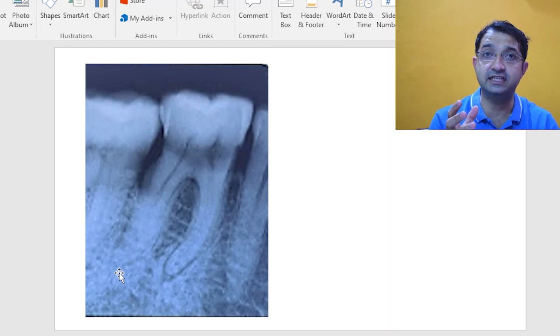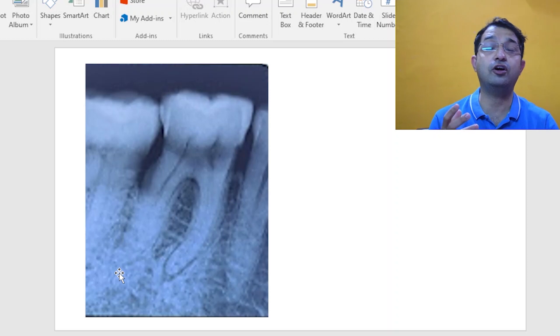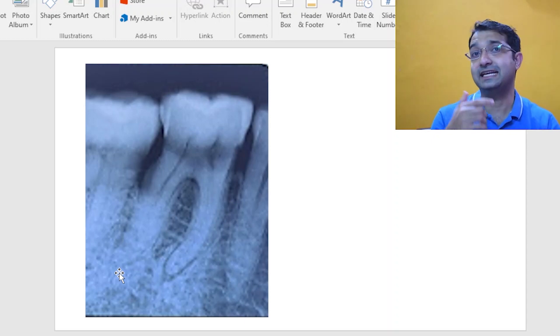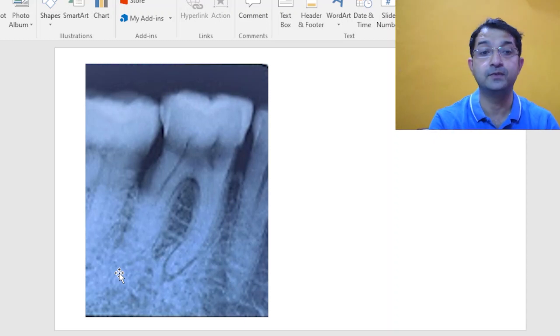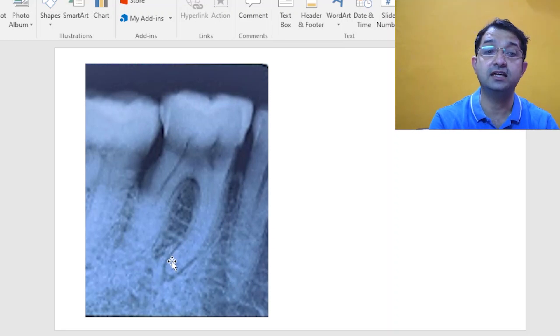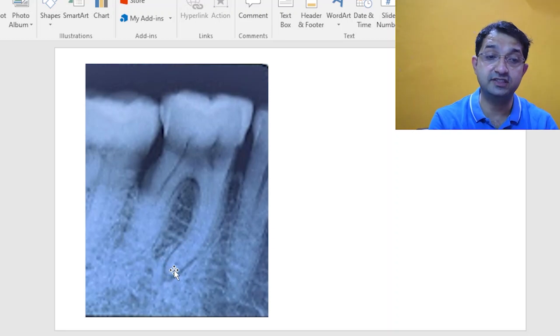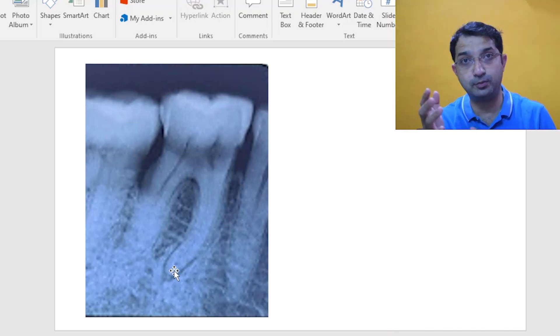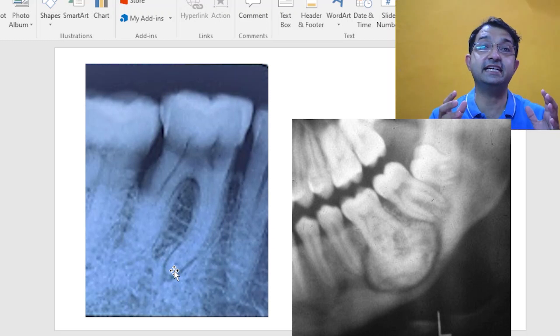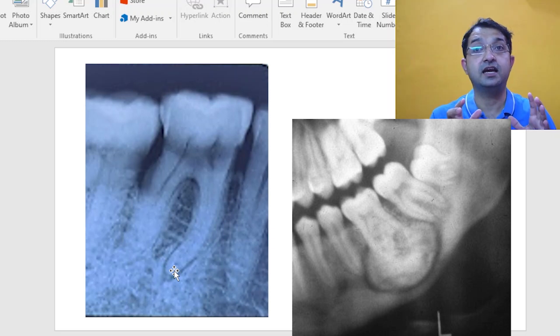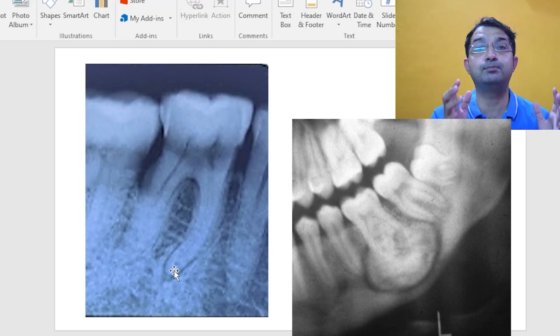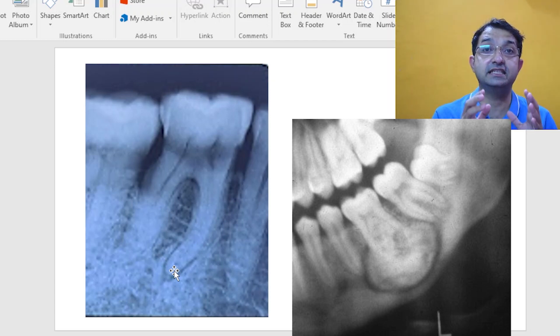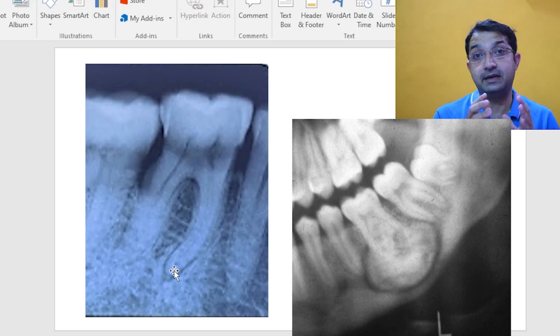The condensing osteitis is because of deposition of bone and that is why it appears radio opaque. So if you see there is a lamina dura, the widening what you see is before the radio opacity, whereas in cementoblastoma you see the lamina dura after the radio opacity. So that's a very important differential diagnostic feature for radio opaque lesion what you see in the periapex.